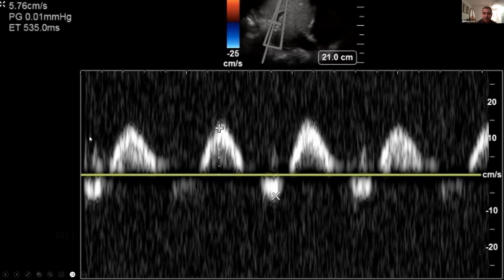So the thing I would expect from the portal vein is this flat profile. There should be no pulsatility here. But look at this. There's almost like a biphasic, almost arterial waveform. This looks like an artery. And so that just tells me that the liver is so engorged that there's compression, there's venous compliance reduction. And what they found is when you see this, CVP is one of the better predictors of AKI. So a dilated IVC is one of the better predictors of AKI. It's a much better predictor of AKI, of cardiorenal syndrome, than cardiac output is.